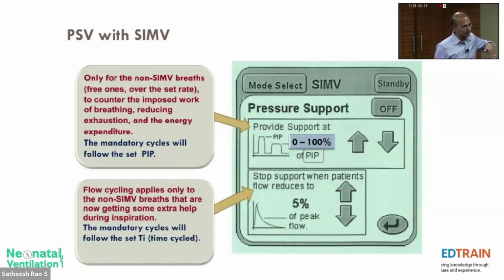If you keep too low a PS, below 8, we don't go, because you want at least 3 or 4 more than the PEEP. So if you keep a pressure support of 10 or so, you can wean the SIMV to fairly low rates and extubate the baby from that. So the tiring out or the atelectatic trauma from the lung closing doesn't happen with this.